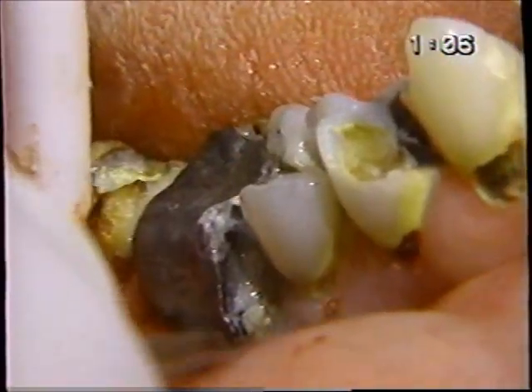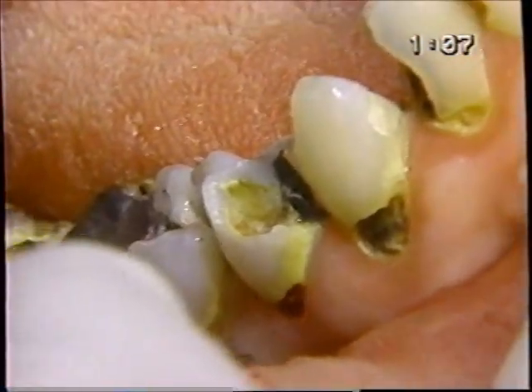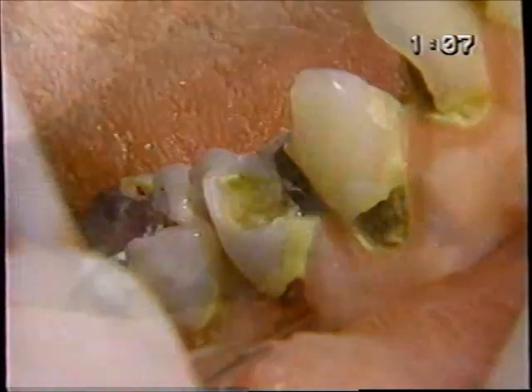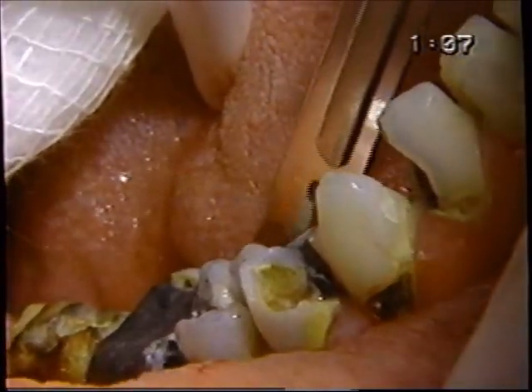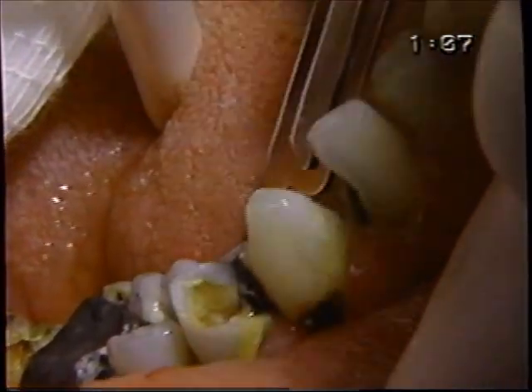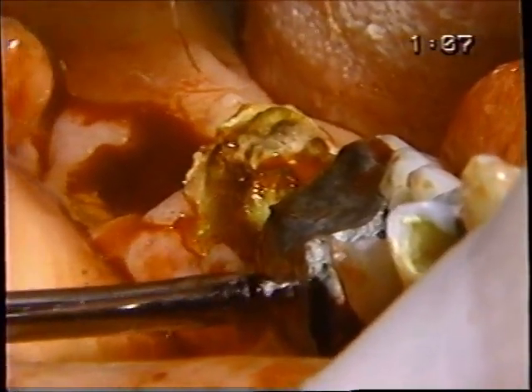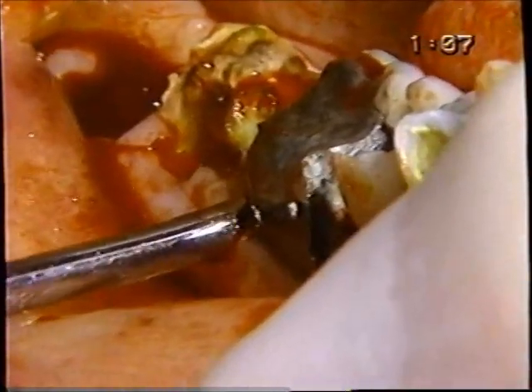Okay. Generally, the first thing I like to do is just excise the tissue that should not be there anyway because of infection. It's just unhealthy tissue. We'll do a similar thing starting actually here between the first and second molar. We don't want to do too much because it may cause some bleeding that would make it difficult for us to see. But why don't we go ahead and luxate the whole quadrant. You don't have to take out the third molar first. It might be easier if the second molar were gone. So let's just kind of play it by ear and see what happens.